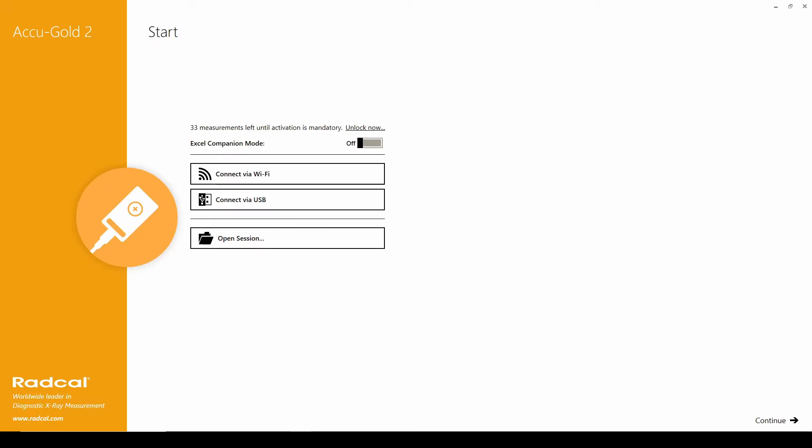In this tutorial, I'll be showing you how to use AccuGOLD 2 companion mode. This feature will allow a user to easily send data to an Excel worksheet as it is collected.